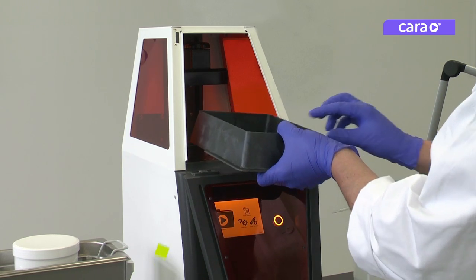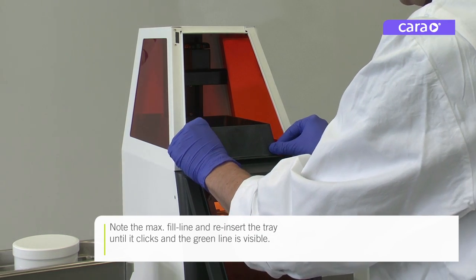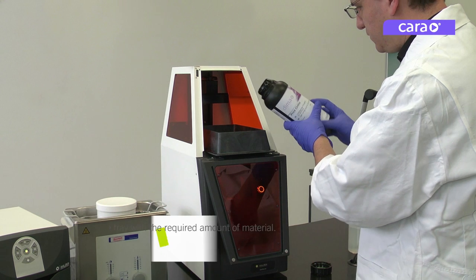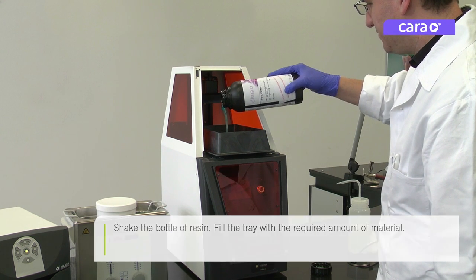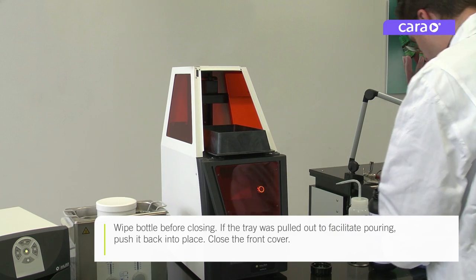Make note of the max fill line and reinsert the tray until it clicks and you can see the green line fully. Shake your bottle of resin before filling the tray with the desired amount of material. Wipe the mouth of the bottle clean before closing.